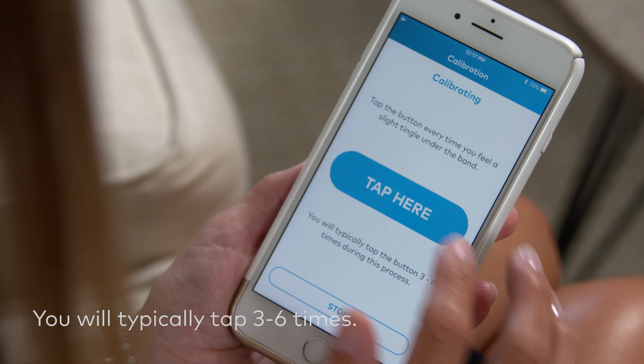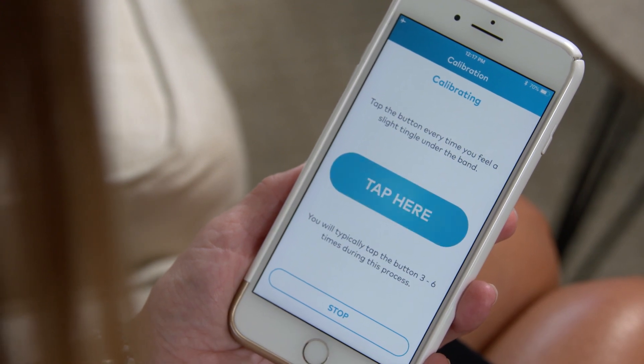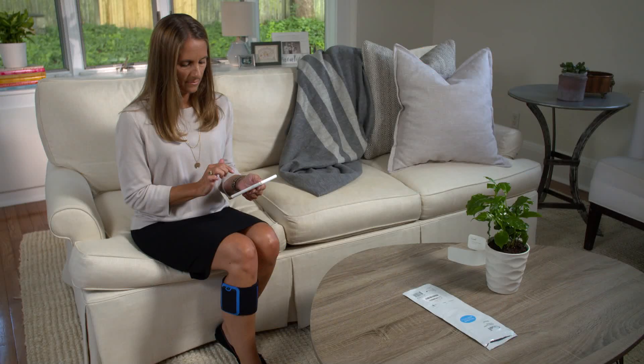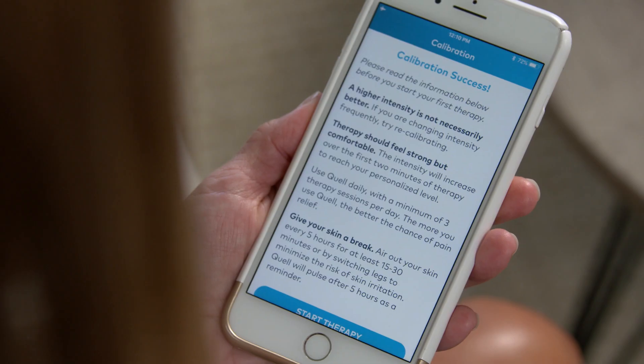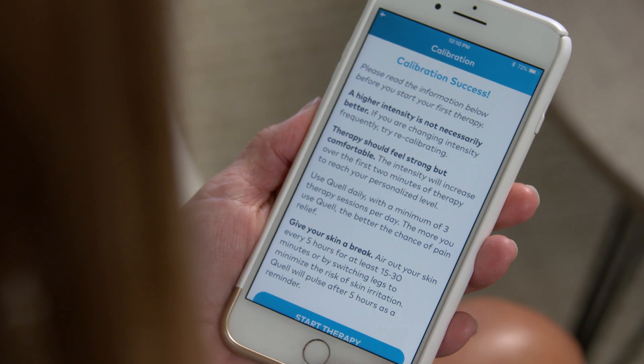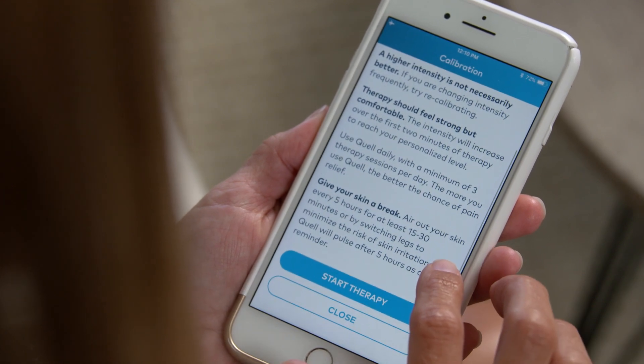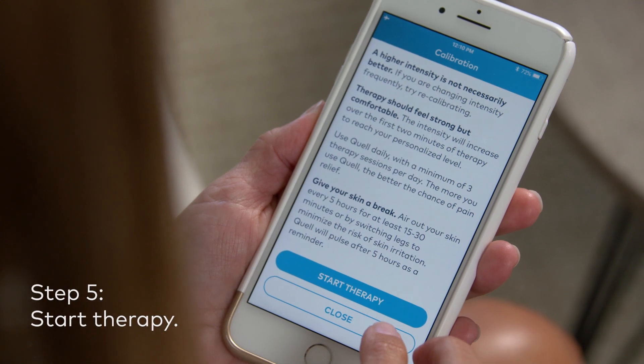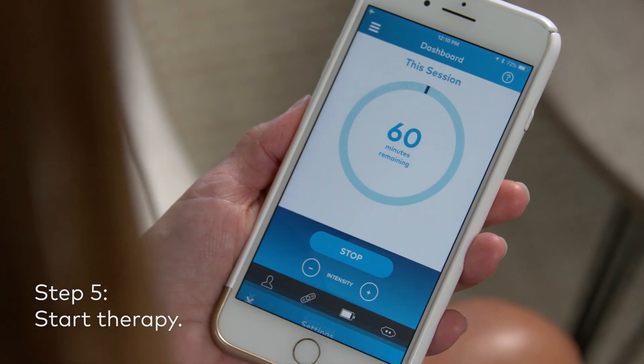If you need to stop at any point, or feel that you have made a mistake, tap the "Stop Calibration" button. You can always recalibrate your device at any time. Once completed, a new screen will pop up that reads "Calibration Success." Read through the information provided, then tap the button that reads "Start Therapy" to start your first therapy session.